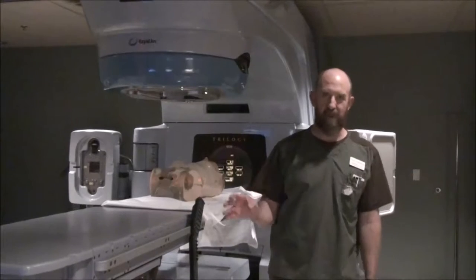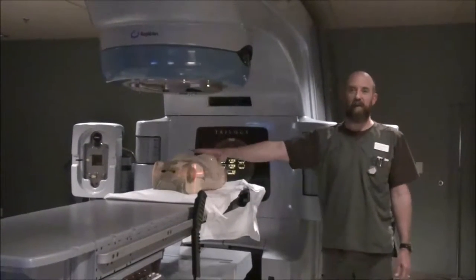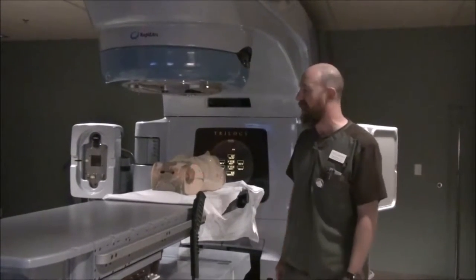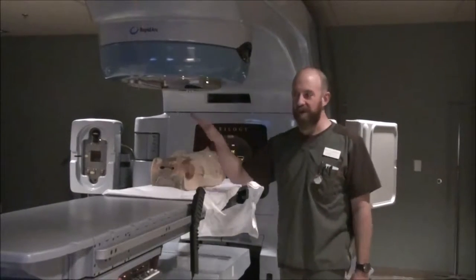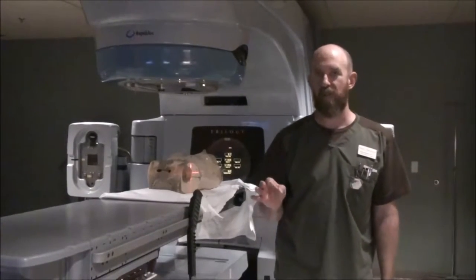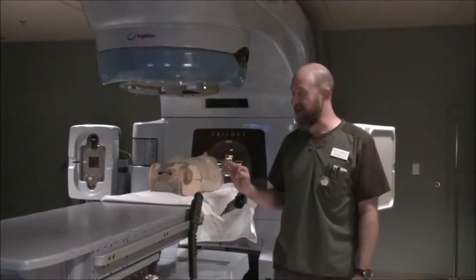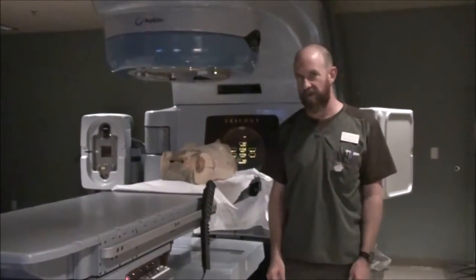So, four kinds of contrast for a pelvis: rectal, oral, urethrogram, and IV. All of those should be done before you really get going — you don't want to get halfway into your sim and realize you need contrast. Go ahead and take care of all that right now. Once you've got your immobilization devices made and your contrast done, the next thing is the ballpark. We're going to pretend we're doing a prostate simulation for this example, because it's easy, shows everything we need to see, and includes the possibility of a urethrogram.